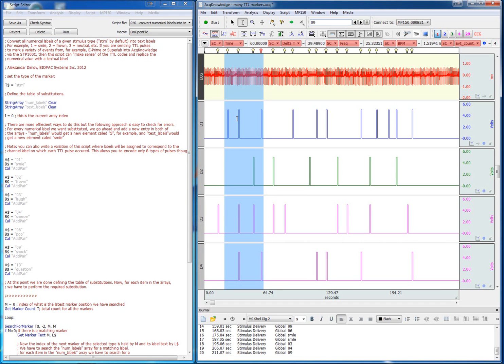These events correspond maybe to a presentation that was done on another computer and the researcher has sent these digital markers to encode the different stimulation events, but they are just text.